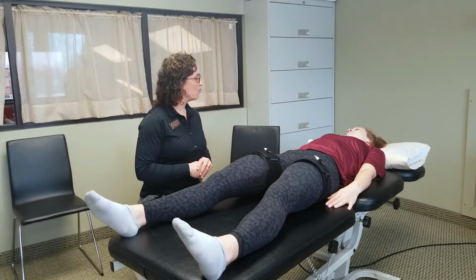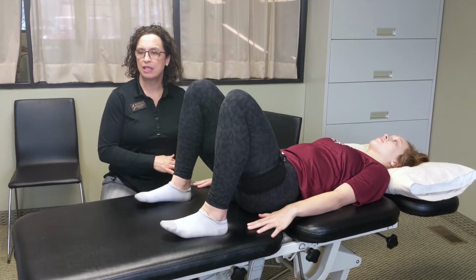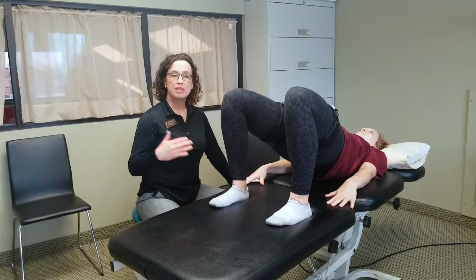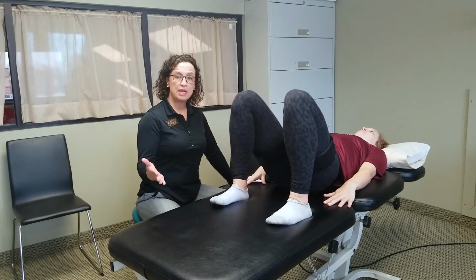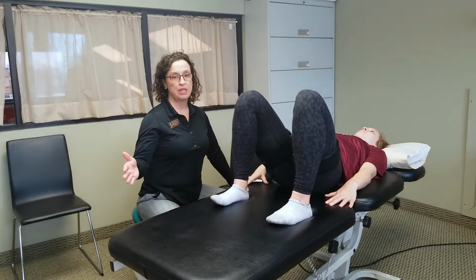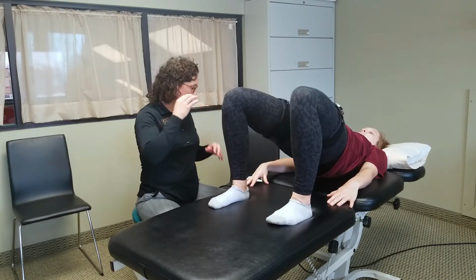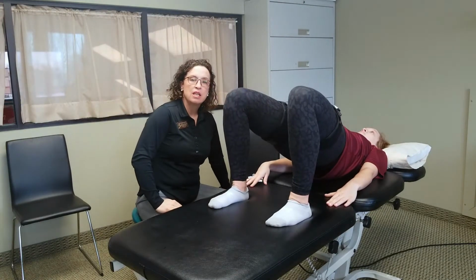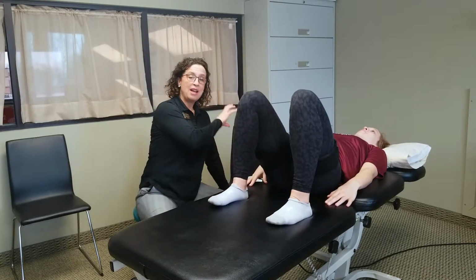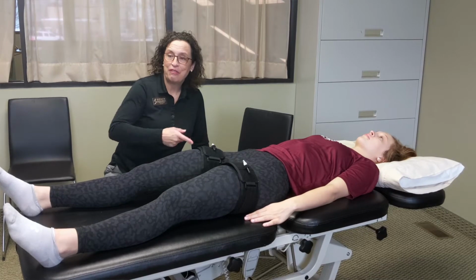Go ahead, Rachel, you got 15 more repetitions. So that lactate production, which we see with high intensity exercise, which we tend to think of giving us that soreness in the muscle like we worked out, we still get the lactate production when we do low intensity exercise with blood flow restriction therapy. We will never get it if we simply do low intensity exercise. That lactate production is part of the chemical soup that causes our body to change the muscle size. We also don't get type 2 muscle fiber recruitment when we do low intensity exercise. We do get it with high intensity, good, 30 seconds of rest, and we get it with low intensity if we use blood flow restriction therapy.